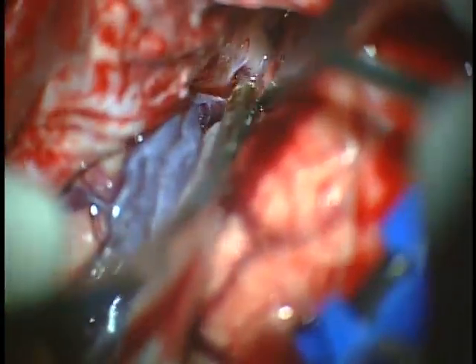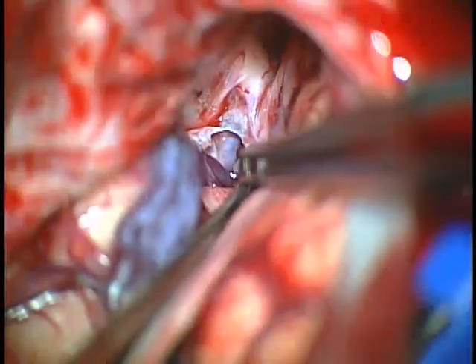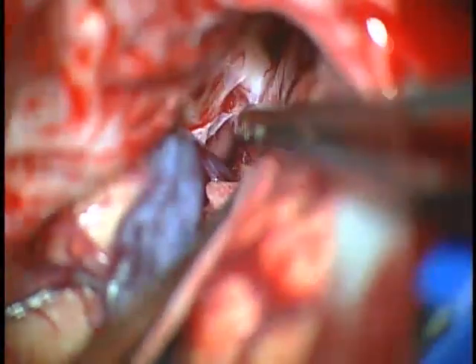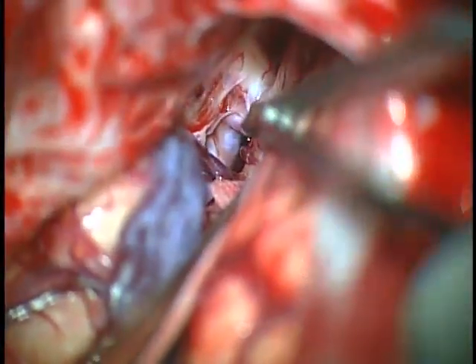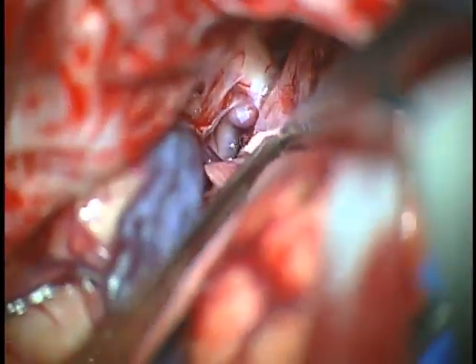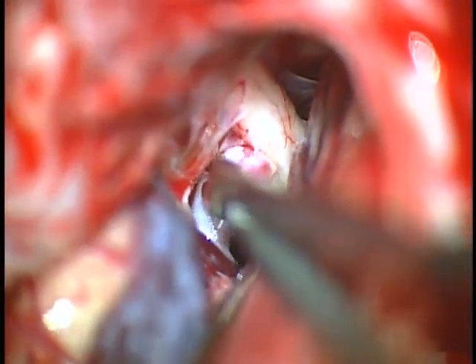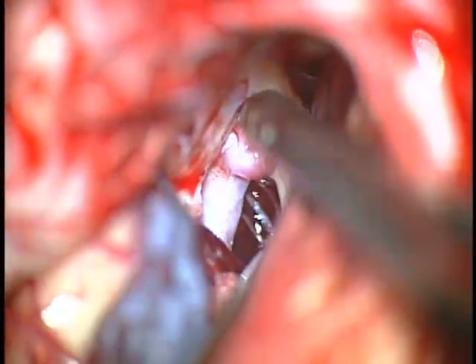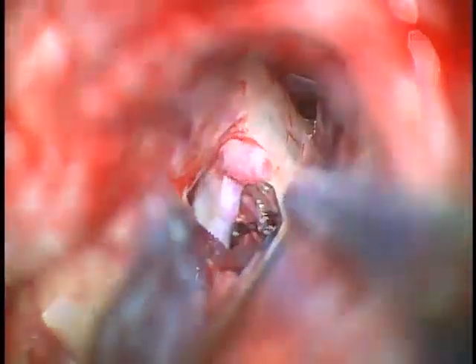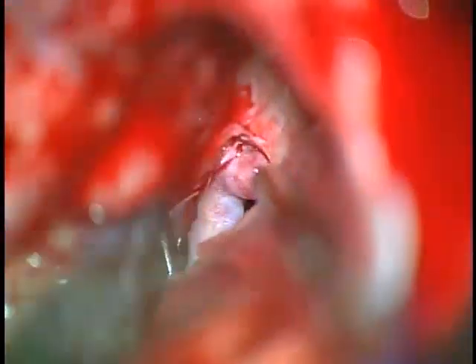The arachnoid tissue is cut until the basal cisterns are visible, as well as the internal carotid artery and the optic nerve. The aneurysm is now under vision, and we complete the dissection around the neck of the aneurysm. The dome is separated from the optic nerve in order to confirm the position of the neck of the aneurysm.